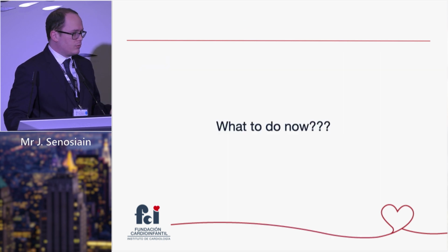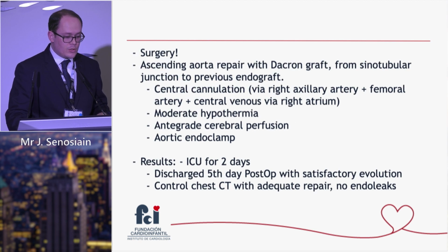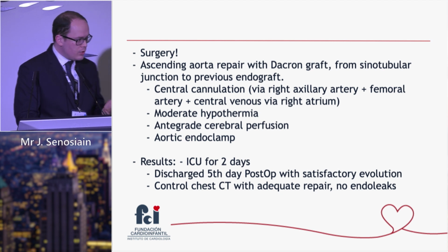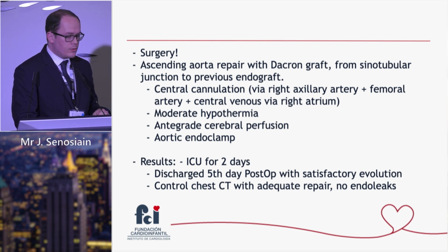So what to do now? It's a very difficult case. We discussed this with the whole heart team in our hospital, and we decided to do surgery. We did an ascending aorta repair with a 30 millimeter Dacron graft from the sinotubular junction to the previous endograft.